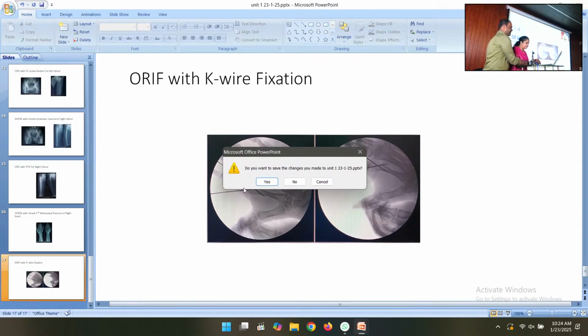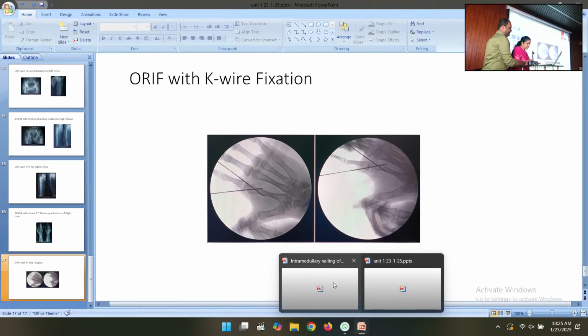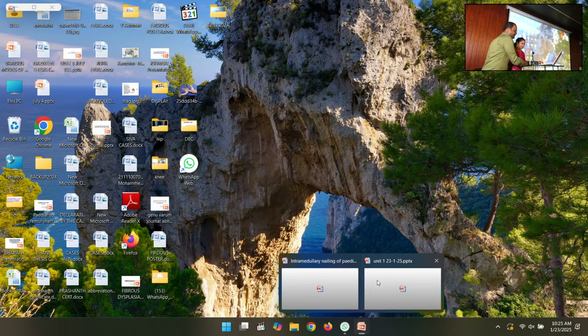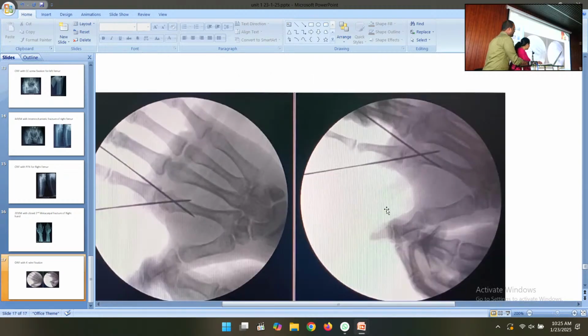One more point. Show the X-ray of the metacarpal fracture. Here, there is one more method of visualizing these fractures. It's almost like an intra-articular fracture. If the fracture is around the neck area, then it is elevated. To treat it conservatively without deformity is difficult.